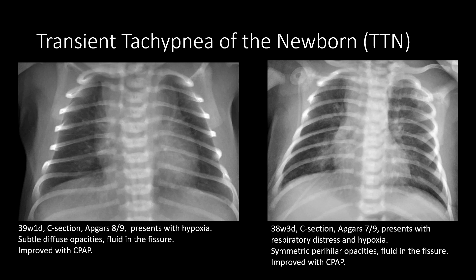You often see perihilar opacities, which are felt to be due to engorged lymphatics and interstitial fluid. You can see fluid in the fissures — this is sort of a disease of too much fluid, thought to be due to lack of compression of the lungs when moving through the birth canal. We can see perihilar streaky opacities and the minor fissure here indicating fluid in the fissure.